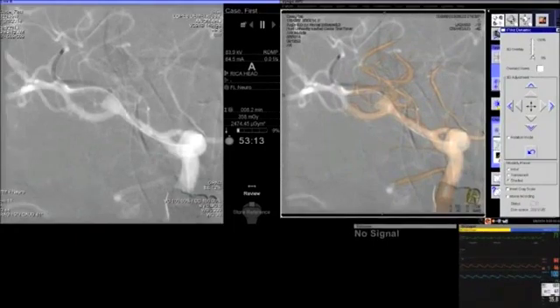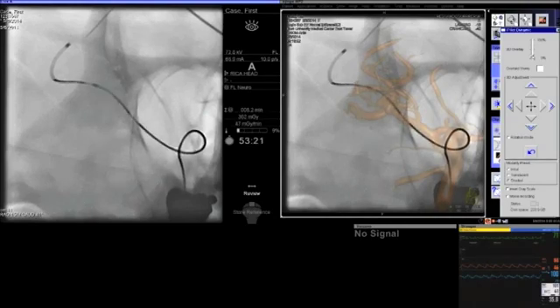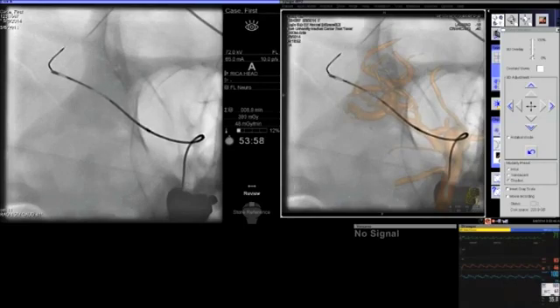So in this case, we chose the shortest Enterprise stent available. One could use an Enterprise without the distal tip. In this case, we have one with a distal tip. The more distal we go into the anatomy, the use of stents or delivery systems that have no distal wire will be more beneficial. In this case, we felt comfortable we had enough of a landing area for a wire.